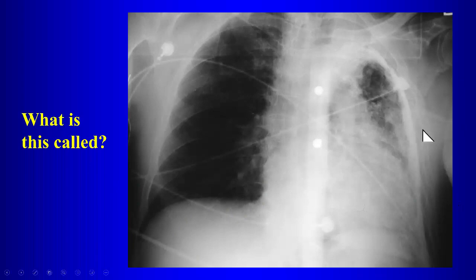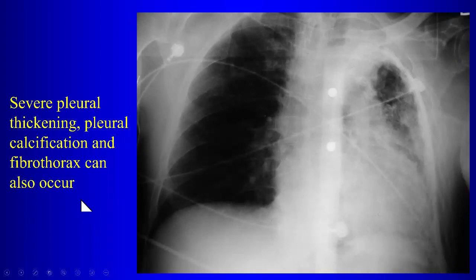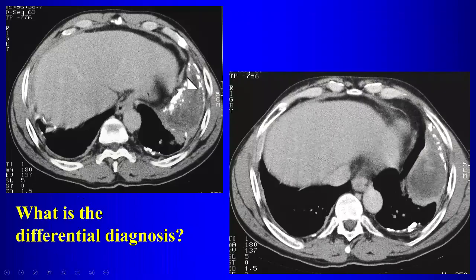Here there is extensive pleural thickening with pleural calcification, and the lung volume on that side is decreased. When we have extensive pleural scarring, pleural calcification, and pleural thickening resulting in decreased lung volume, the term for this appearance is fibrothorax. This decreases ventilation and impairs physiological function of that lung.